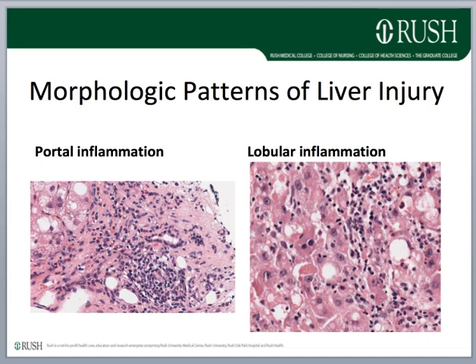Nothing too tricky there. Now, we'll talk a lot more about this in the next case as opposed to the current case. So I'm not going to go into too much more detail about this. And in reality, oftentimes you see inflammation in both microanatomic compartments.